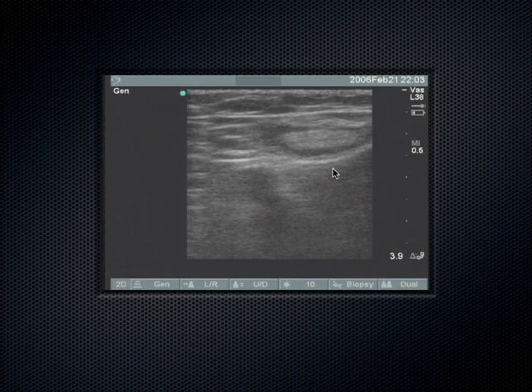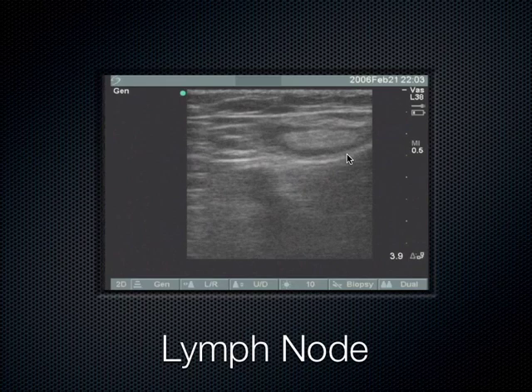This is a very enlarged lymph node. And we see that in cases of infection. So there's an infection downstream, down the leg, maybe around the calf or something. The skin's kind of red, the leg is kind of swollen. And then you don't see DVT, but you see a really enlarged lymph node. It helps sway you clinically towards cellulitis or infection and away from DVT. That's an inguinal lymph node. Correct. Inguinal lymph node.